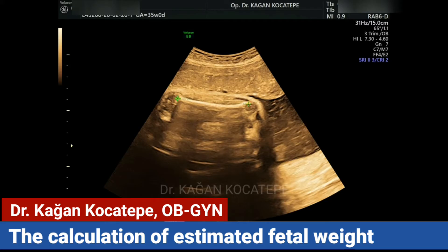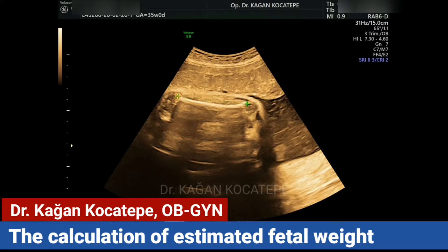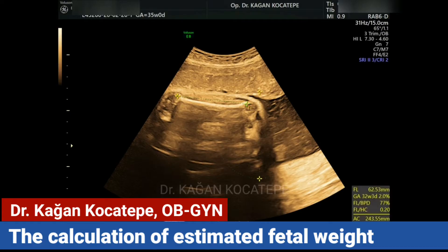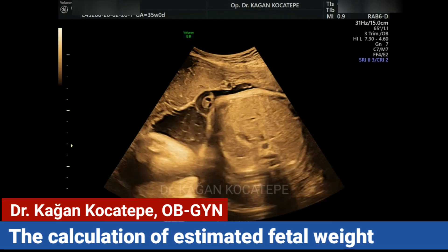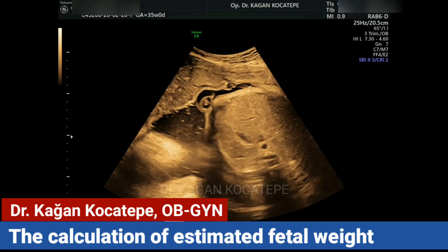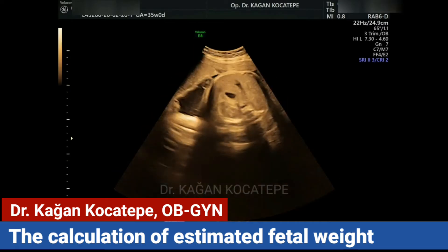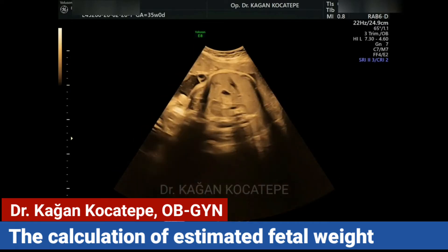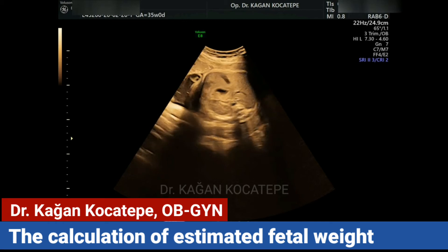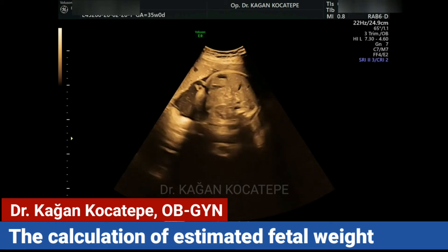Finally, the fourth measurement to predict the fetal weight of the baby — the most important one — is the abdominal circumference, the AC level.